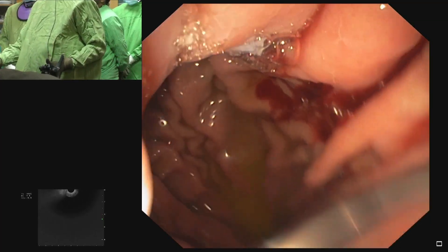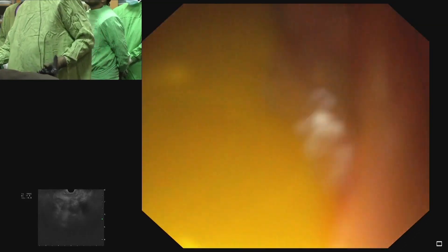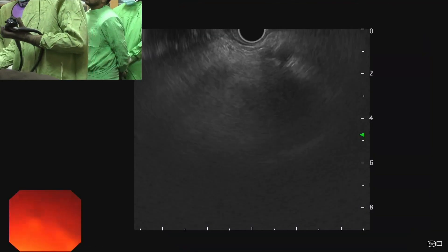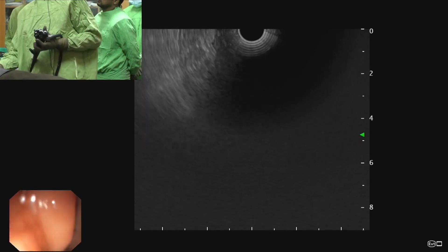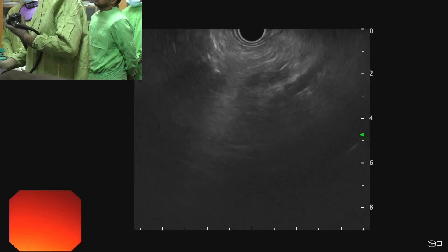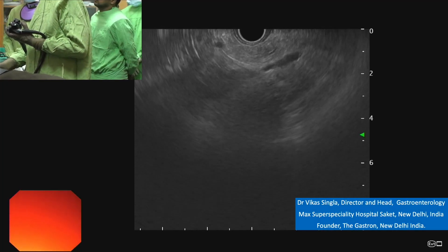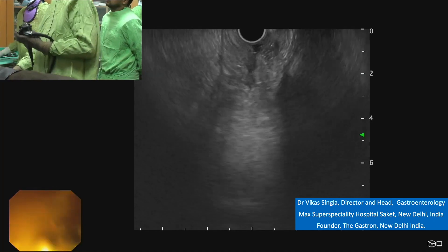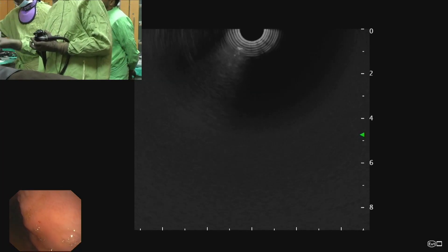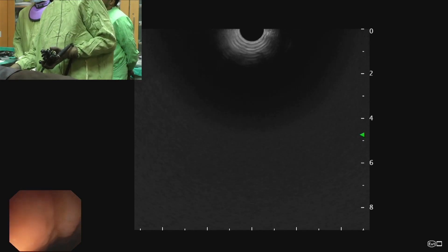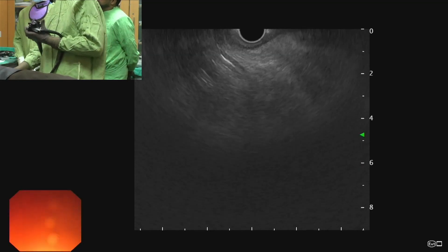On the right side is the lesser curve and on the left side is the greater curve. On the right side we can see an angle — this is the angle. So here we rotate the scope counterclockwise. We go up across the lesser curve and on the right side we can appreciate this angle. We go inside and rotate the scope clockwise.